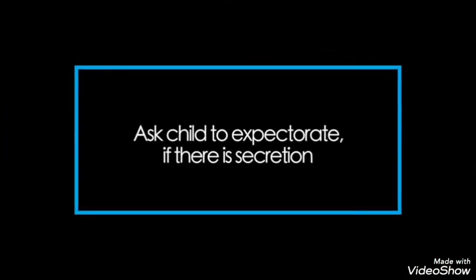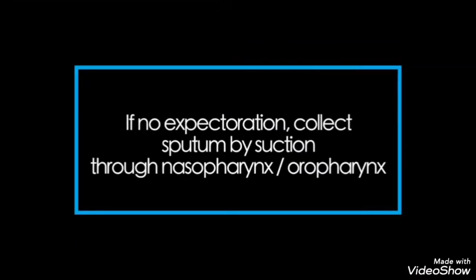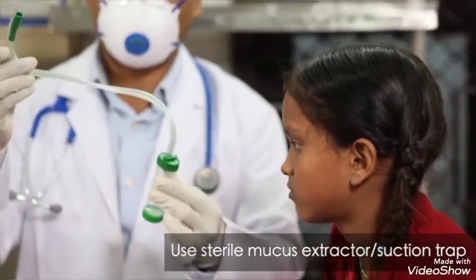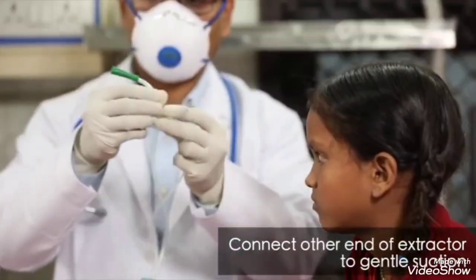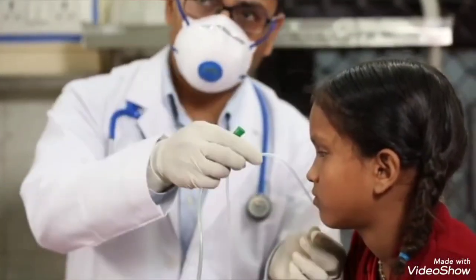If there is sputum production and the child can expectorate, collect the sputum in sterile container. If still the child is unable to expectorate, or if it is a young child who needs assistance to collect secretions, then sputum can be collected by suction through nasopharynx or oropharynx. Use sterile mucus extractor or suction trap with the other end of the extractor connected to gentle suction of around 100 centimeters of water.